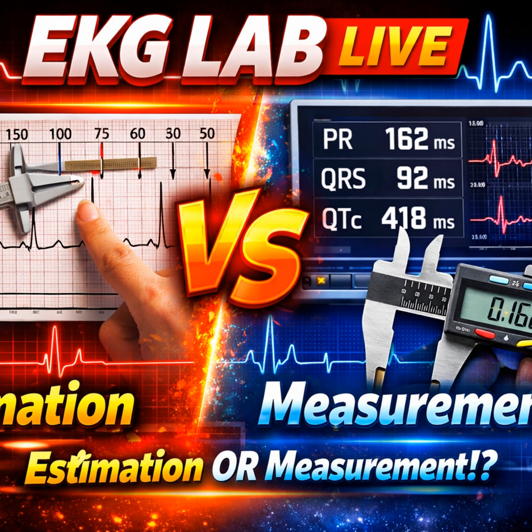I knew you would bring that stat up. It is not just a stat, it is a warning. If a patient comes in with a story that sounds like indigestion, and you let that history anchor your interpretation, you might miss the subtle ST elevation of an inferior MI. The sources show that history creates anchoring bias and confirmation bias. You start seeking features to confirm the story rather than reading the strip. To get an accurate reading, you should use the uniform approach. You read the EKG blind first using the box method to ensure objectivity.